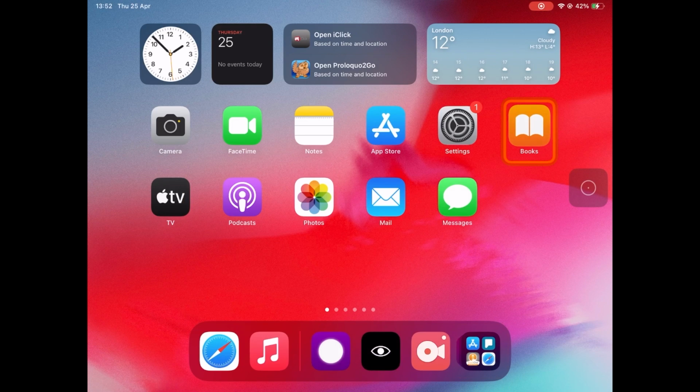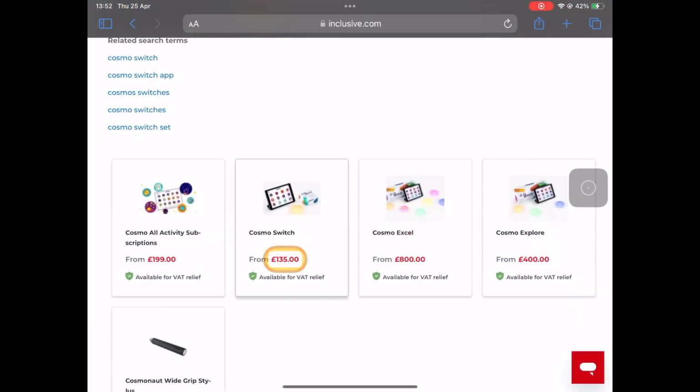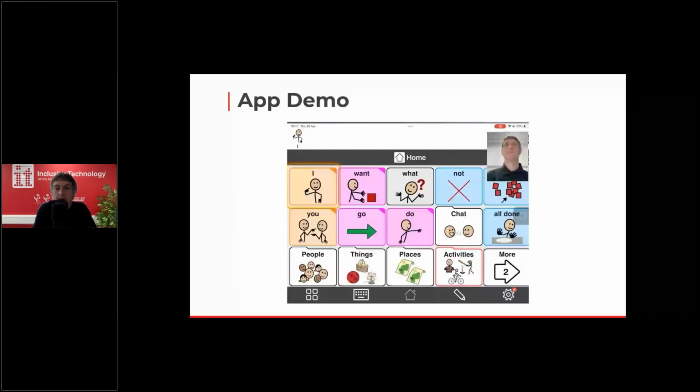So that was the setup of the hardware. You can see now I can use eye tracking to move, use Snap to highlight the apps on screen, and then lastly to select, of course. Okay, so that was the setup on the app.